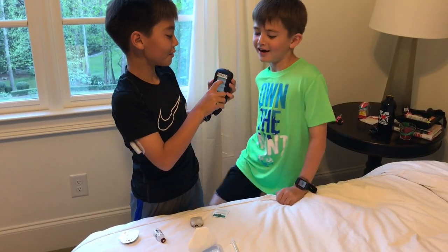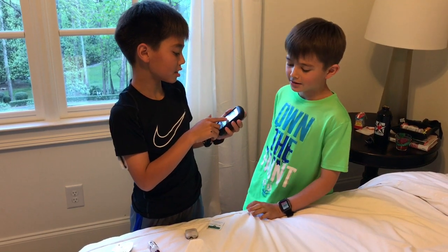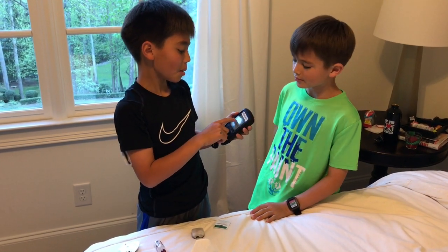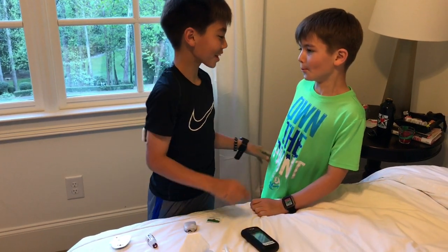It says remove pod's adhesive backing. If the pod is wet or dirty, or adhesive is folded, press discard. If the pod is okay, apply to the site. We'll be putting it on the leg.